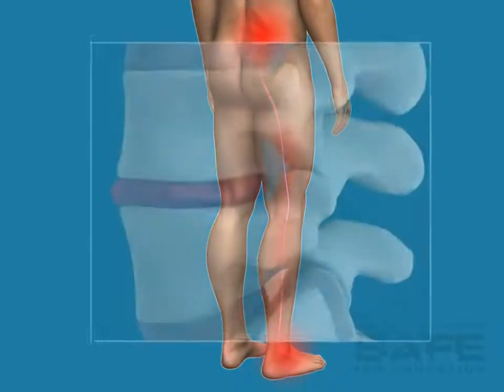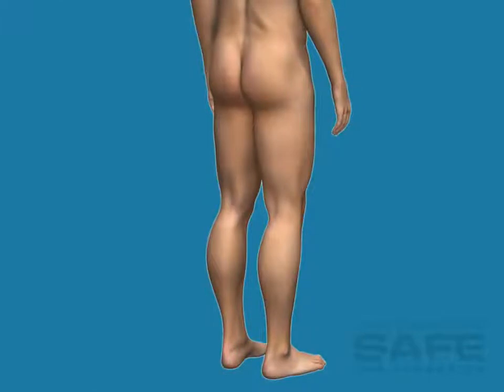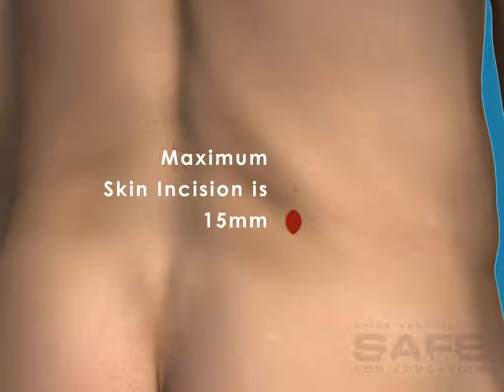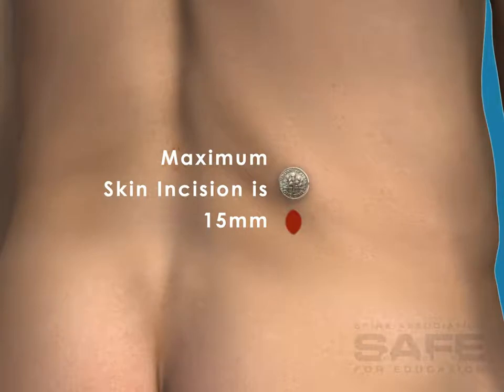This procedure is intended to reestablish the height of the disc, reduce movement of the disc, and alleviate pain. Compared to traditional spinal fusion procedures, the OLIF is a less invasive surgical technique that does not require removal of any bone or ligament structures. An OLIF procedure only requires a skin incision of 15 millimeters.